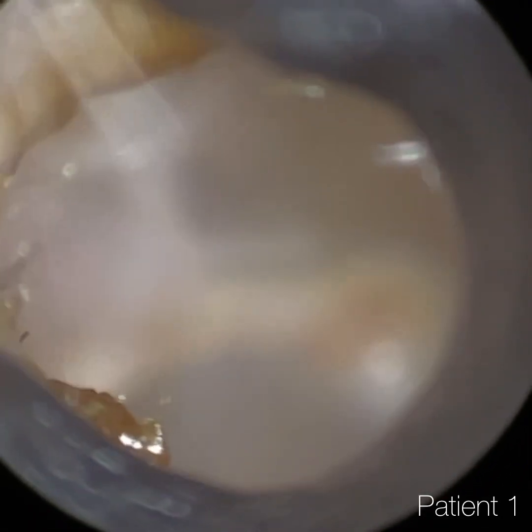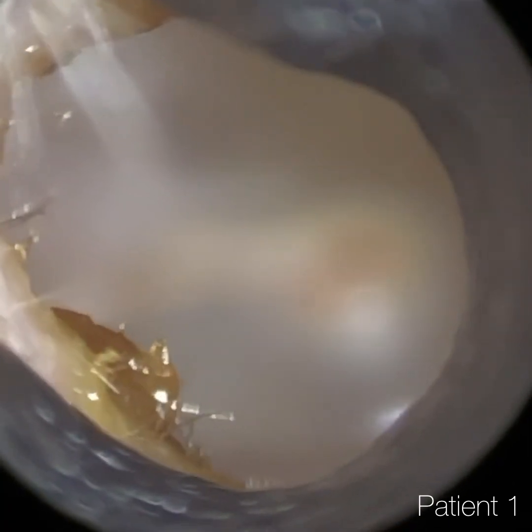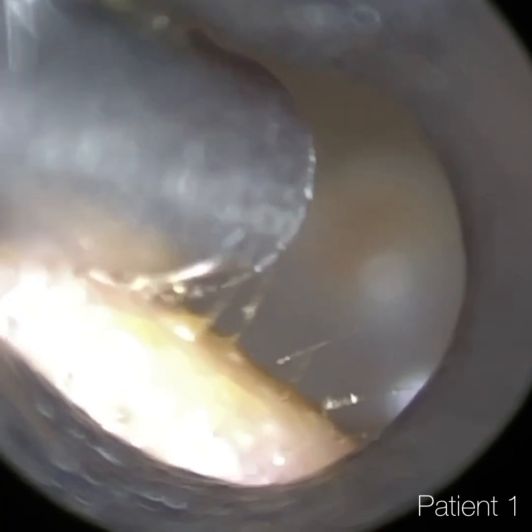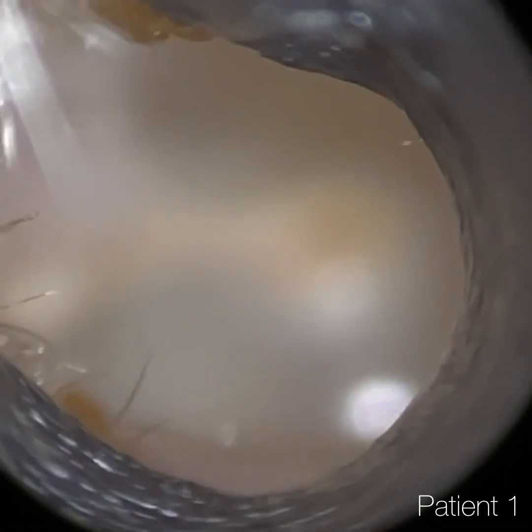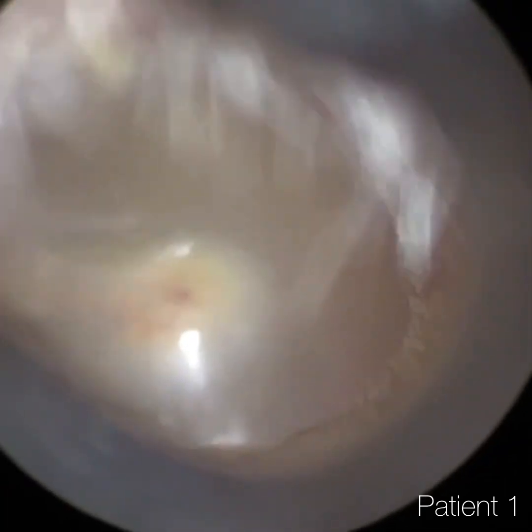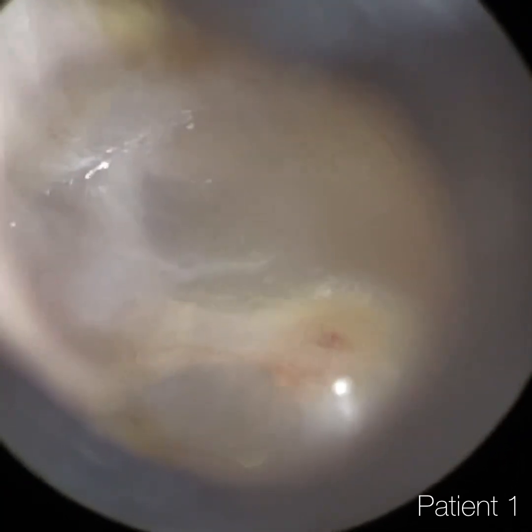So I had a husband and wife duo as patients that I attended today, and I'll let you guess whether patient one is the wife or the husband. I suspect after seeing patient two, you'll make that decision a bit easier if you stay tuned.